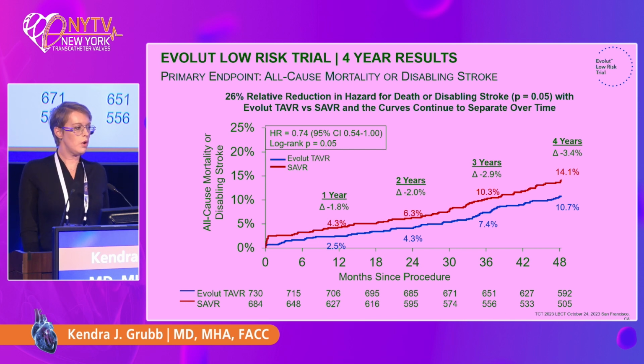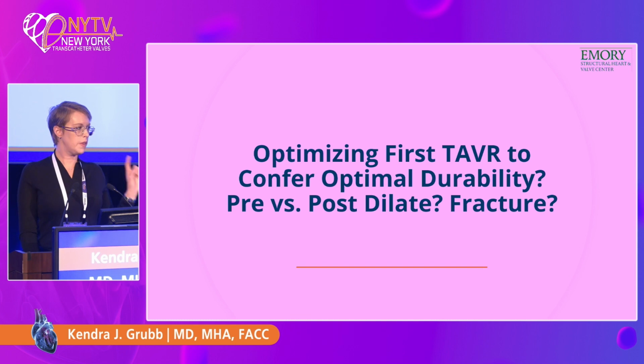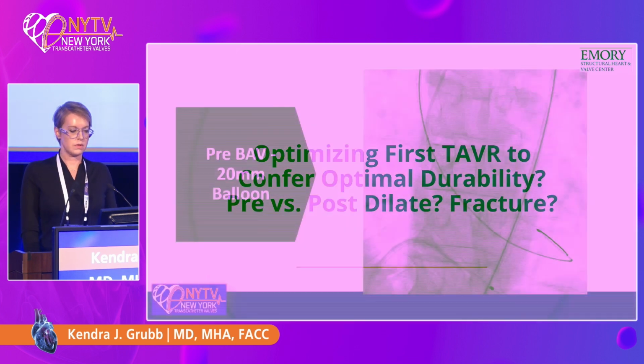And so we don't know what real durability is. So this gives me a good idea that durability is going to be appropriate no matter what this patient selects. So when we talk about optimizing the first valve, pre-dilation, post-dilation, fracture, all of these things have to be taken into consideration. But the planning starts with the initial CT. The planning doesn't start when the valve fails.